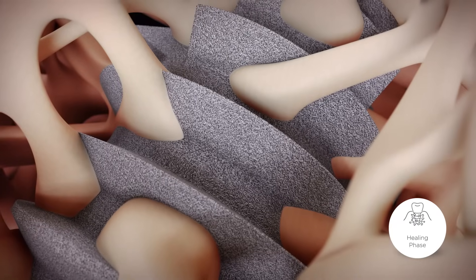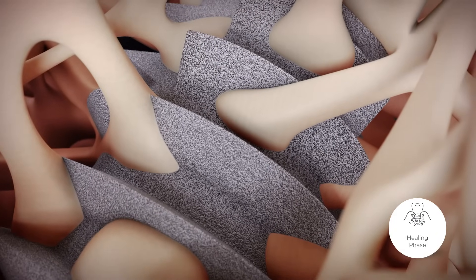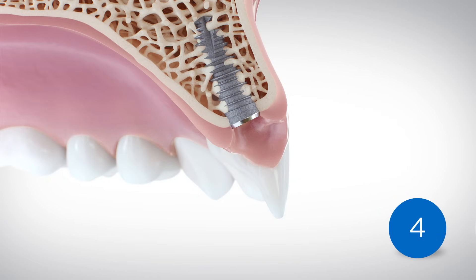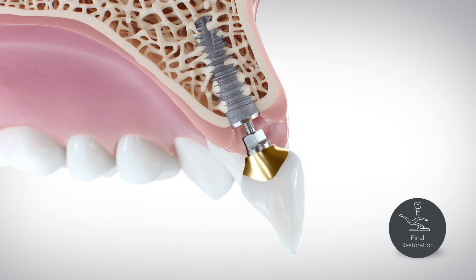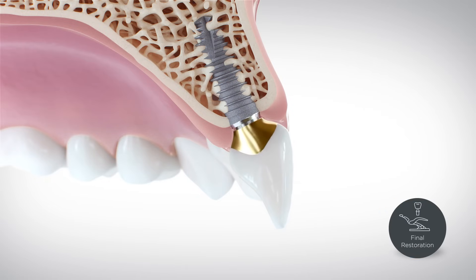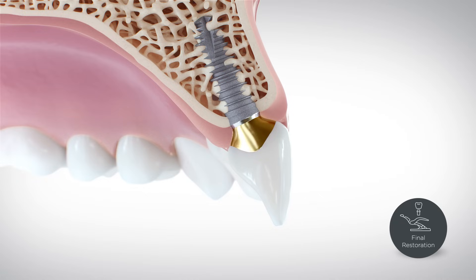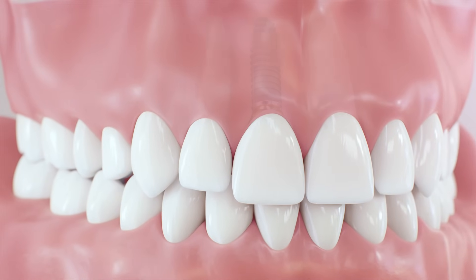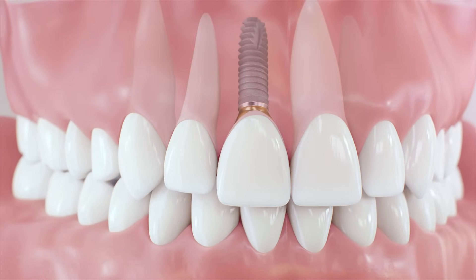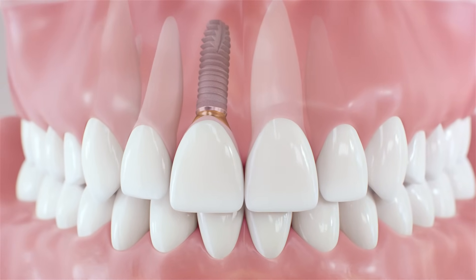Ask your dentist about your personal healing time. Once healing is complete, the temporary abutment is replaced with a permanent one during step four. Your new tooth is now in place, feeling and functioning like a natural tooth.